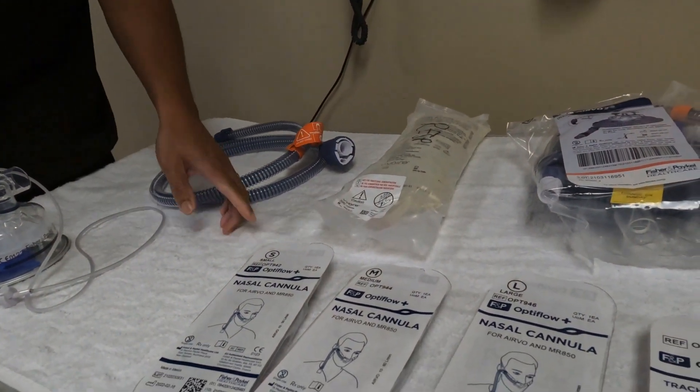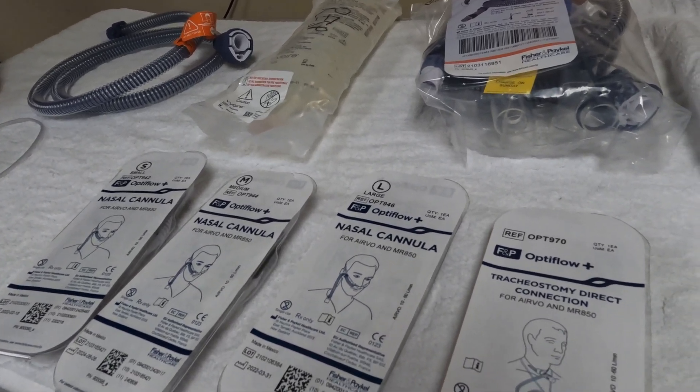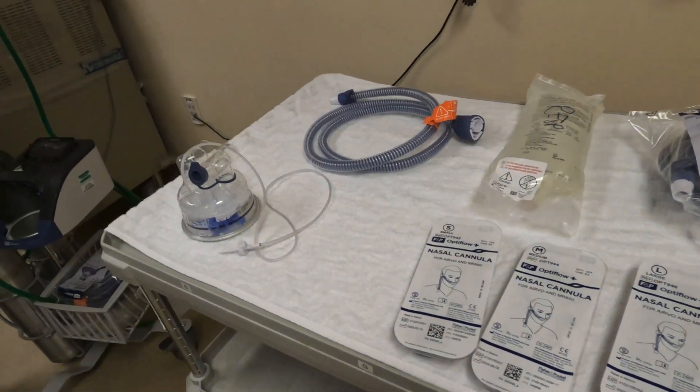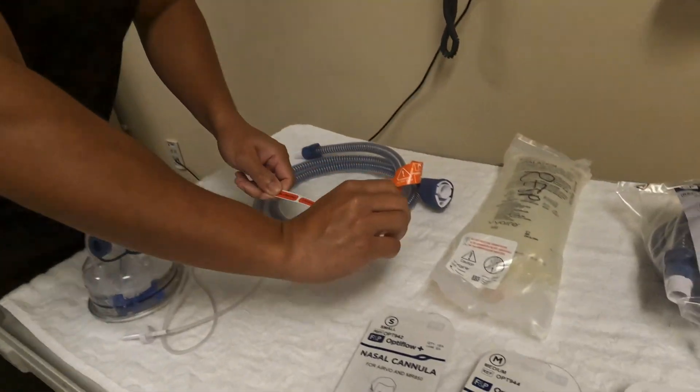We have three sizes: small, medium, large, and we also have the tracheostomy adapter. And last, we'll also grab some red stickers to be placed on our sterile water for inhalation.